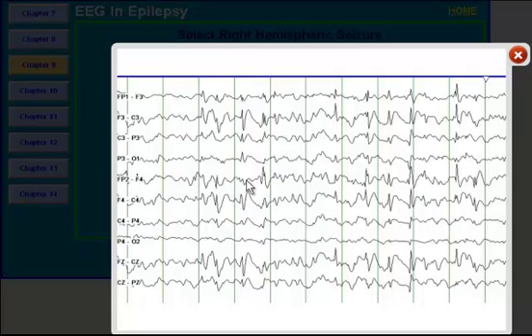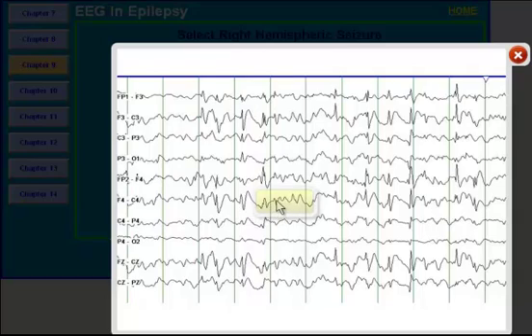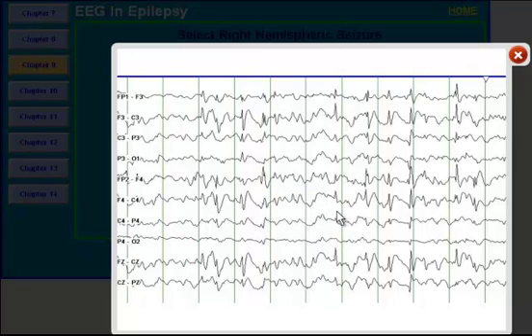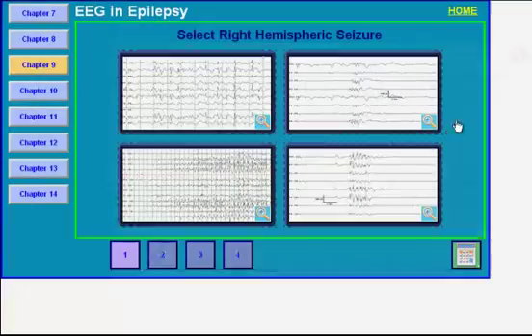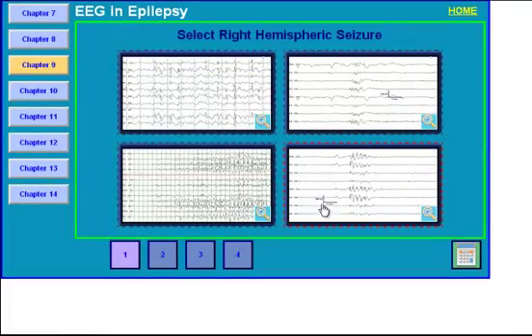The syndrome where you see this is patients with Lennox-Gastaut syndrome. You see generalized slowing between two lines with frequencies of 1, 2, 3, 4, 5 which is theta frequency. Then you see a very slow wave here, so this is delta frequency. So you see background slowing in delta and theta frequencies and sharp waves that are seen in both hemispheres. This EEG does not show an electrographic seizure.